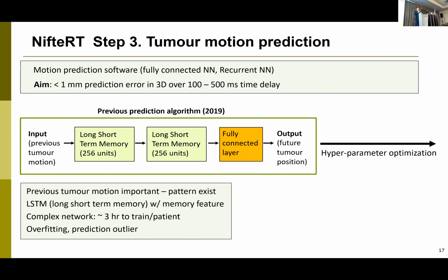So let's come up with the algorithm that we can optimize this structure for each patient, right? By the way, you may go through the same problem in your research project if you want to use in vivo data. It's really hard to get sufficient amount of data to train complicated neural networks. So I had to deal with this, work with whatever I had.